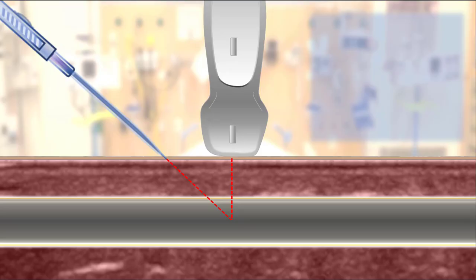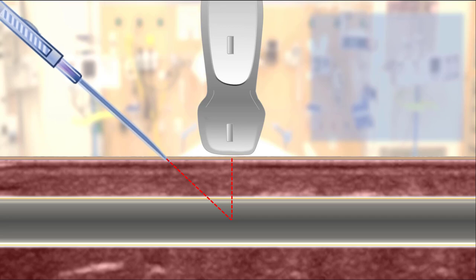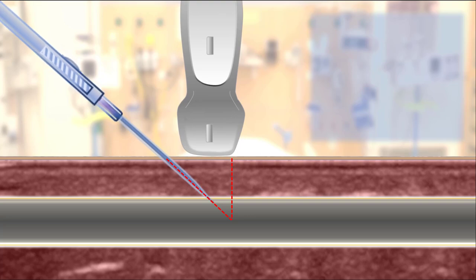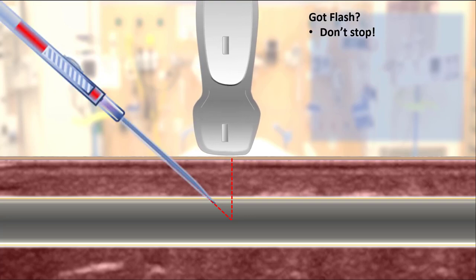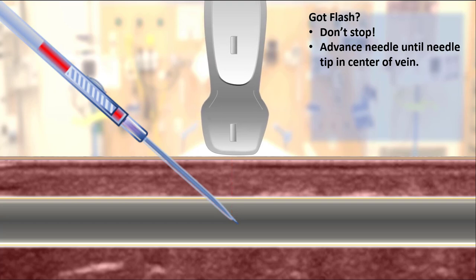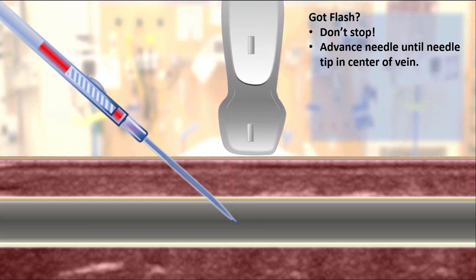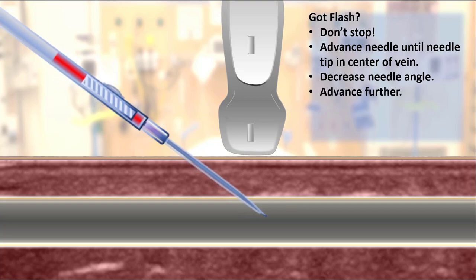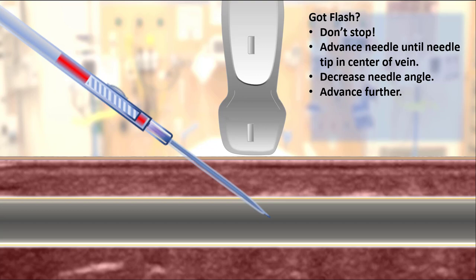Here we see a depiction of an ultrasound-guided IV placement in cross-section. The operator's goal is to always keep track of the needle tip until it is seen in the center of the vein. Once the needle tip is identified just under the skin, the probe is advanced in small increments with the needle likewise following in small increments until it again can be seen on ultrasound. Once you see flash in the chamber of your catheter, don't stop. Unlike a landmark-guided approach, with ultrasound you only advance the catheter off the needle once you visualize it in the center of the vein. You may need to decrease the angle of approach to create space for advancing the needle. Remember that the central element of the whole process is to never lose track of your needle tip.